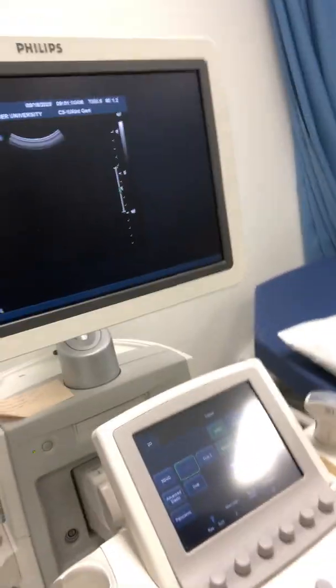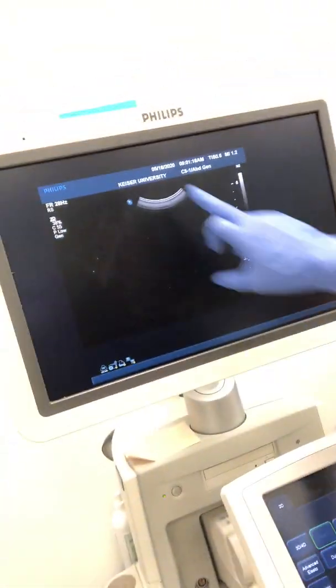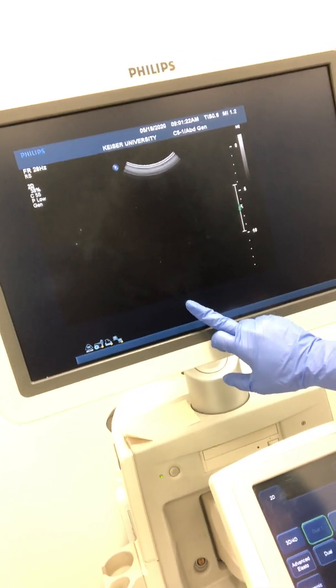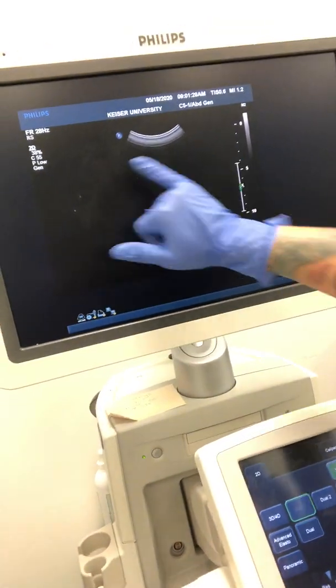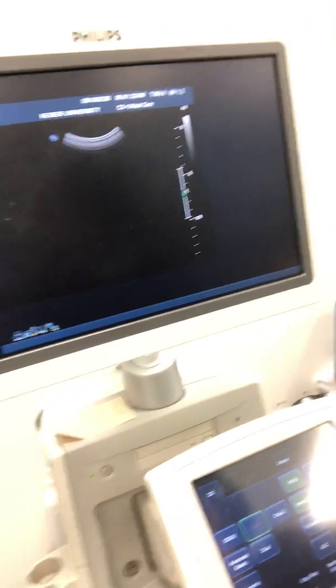are only going to change if you move your probe into a different area of scanning. So let's say, again, you're scanning from an anterior approach. It's going to be anterior to posterior, and then you would have to physically move your probe to the coronal position in order to change this. It's not going to change. The only thing that will change is where your notch or your indicator is. And again, this is assuming that you stay from the anterior approach.